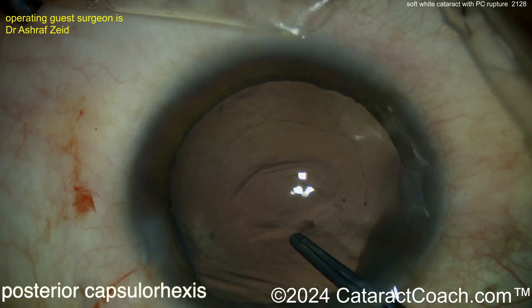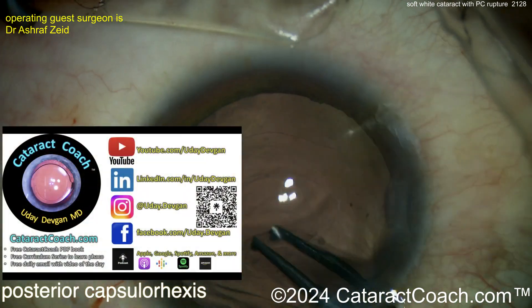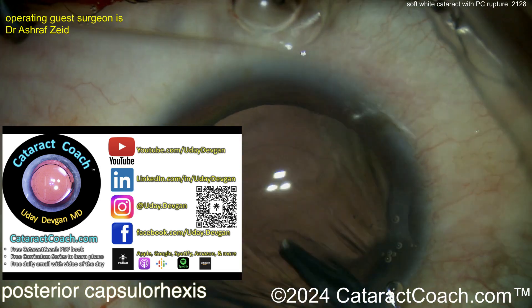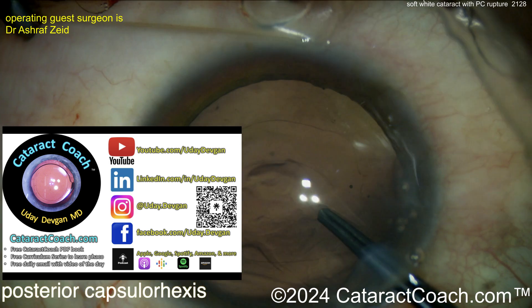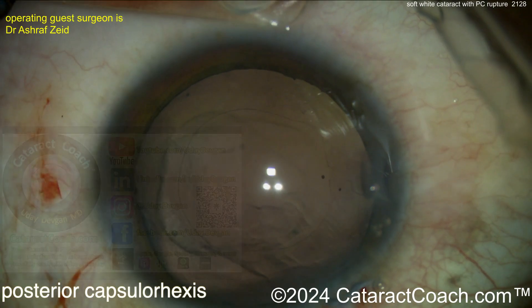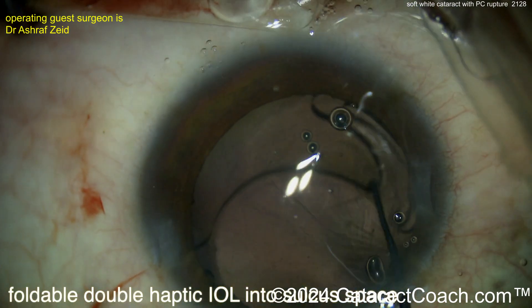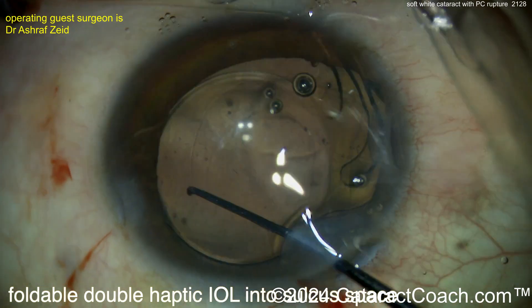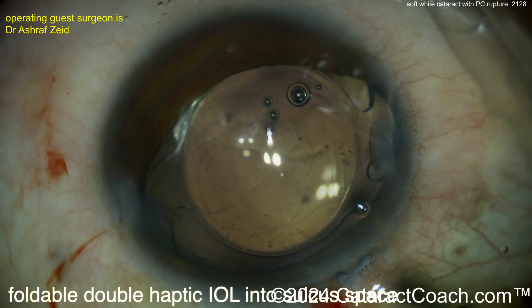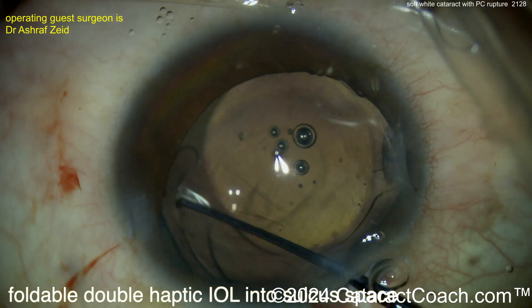Trying to complete this posterior CCC — this is an optimal phase. Here I'd like a three-piece lens with the haptics in the sulcus and the optic captured. Time for the lens — a little more viscoelastic. A foldable lens is going in. You can't put the lens in the bag initially, so it's being placed in the sulcus first, and then getting those haptics positioned — I would have preferred a three-piece lens here.